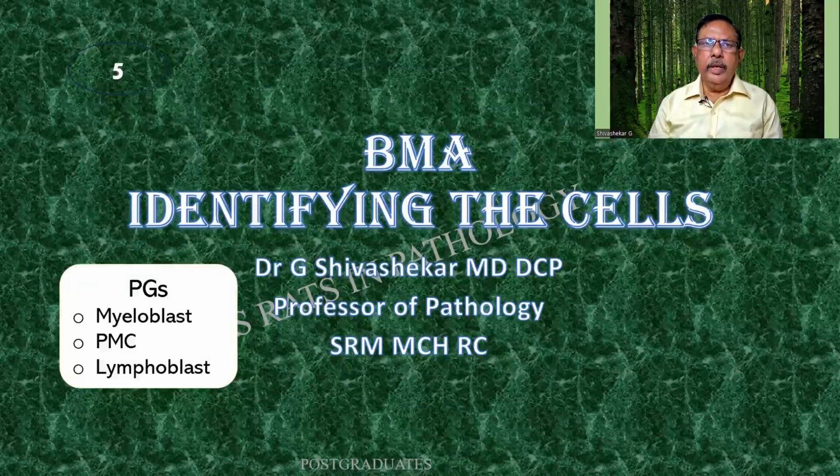I shall be continuing with my classes on bone marrow aspiration. And today's class is identifying some cells such as the myeloblast, the lymphoblast, and the promyelocyte.